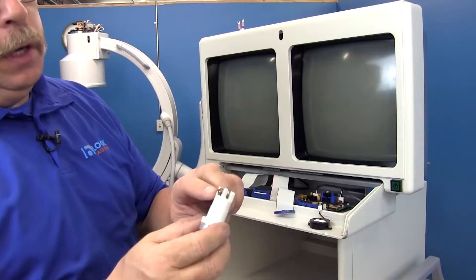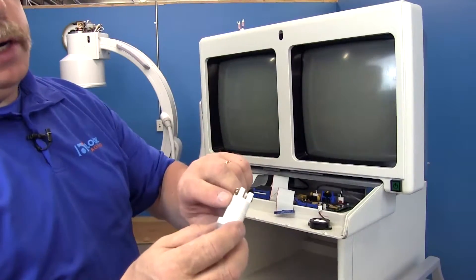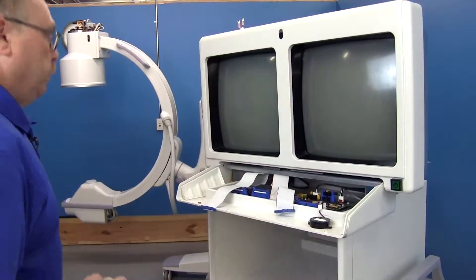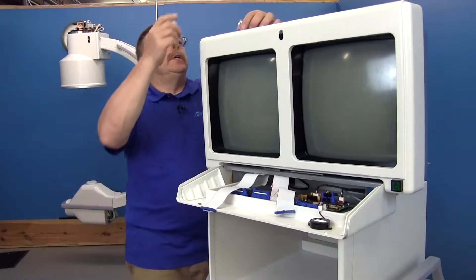Reinstalling the x-ray illumination — you want to make sure you put the white wire on the positive side, which most of these are marked. Just feed your wires up through here.